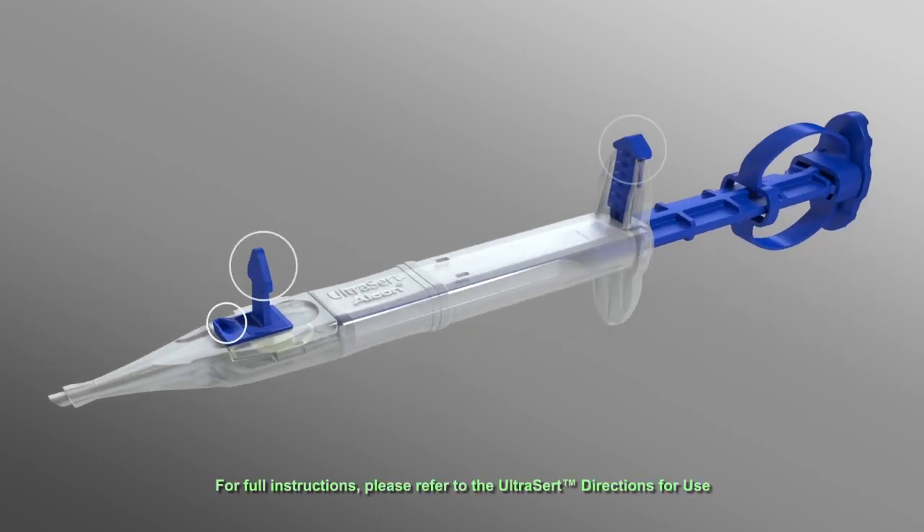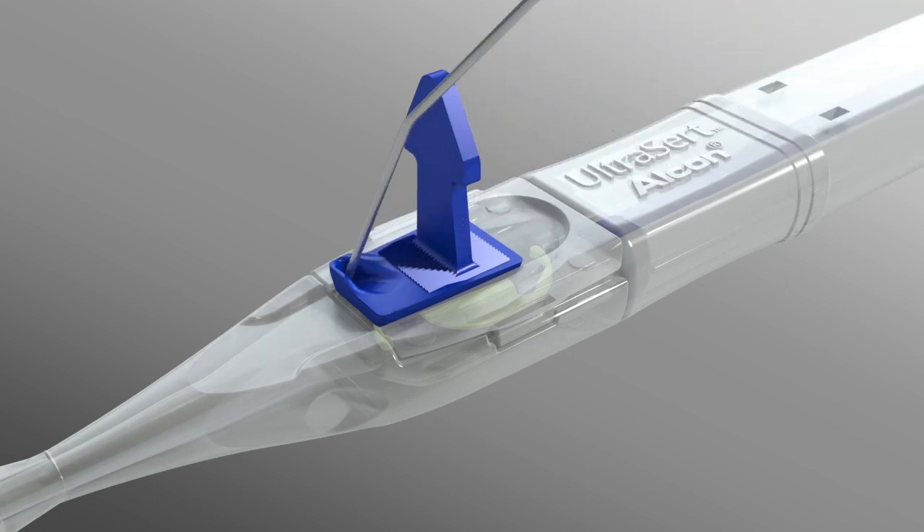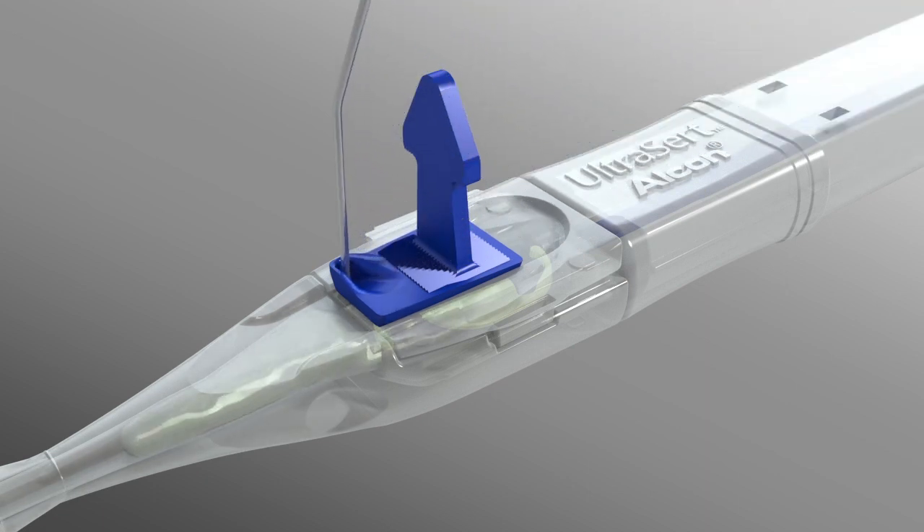First, fill the front chamber with a qualified viscoelastic to the fill-to line. This is the only approved fill method.